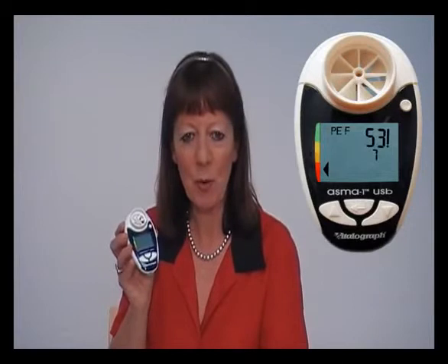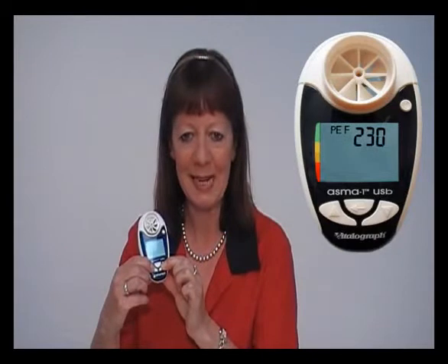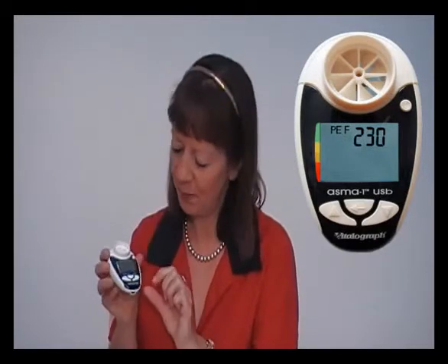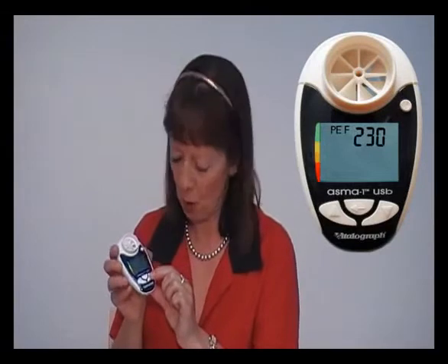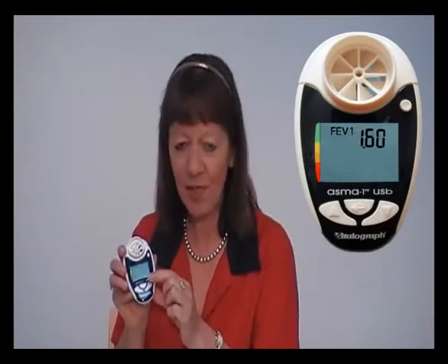With VitalGraph AsthmaOne, you also have the facility to enter your own personal best measurement for peak flow and FEV1. Simply switch the device on and hold the up and down arrows together for three seconds. Use the up arrow to scroll up to your personal best peak expiratory flow and then press the enter button. If you wish to enter your personal best FEV1, this is done in the same way by pressing the up arrow to reach the value and then the enter button.